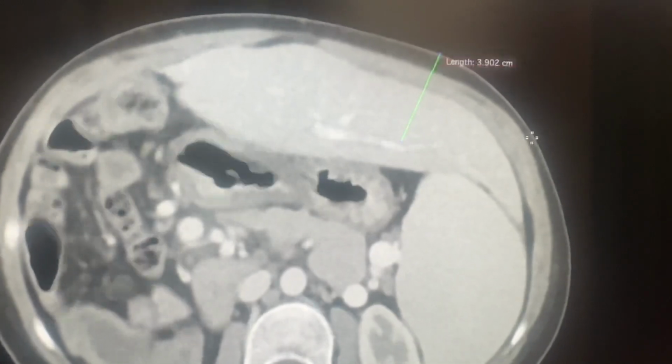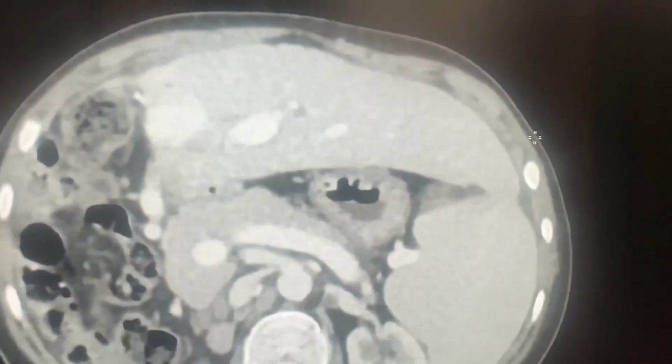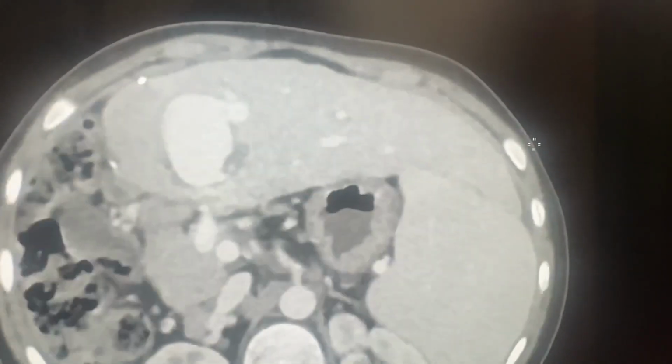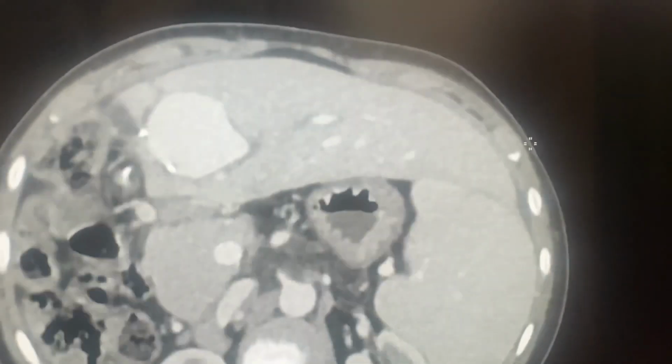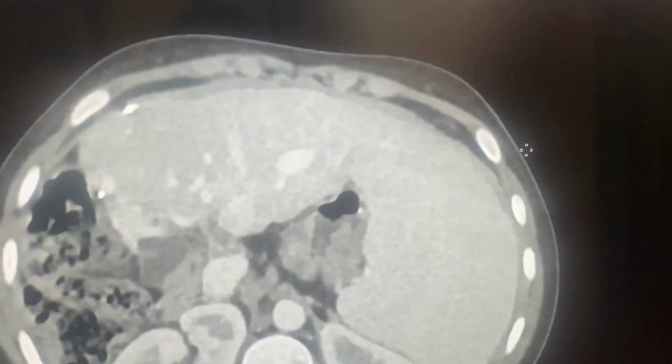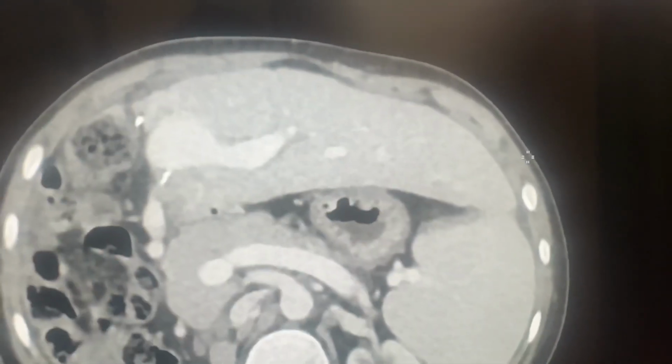And we choose this portal vein because it is extending quite peripherally, and you need to have that much length of the portal vein for the wire to traverse and for you to negotiate into the narrow segment. So always choose and puncture the portal vein quite peripherally.